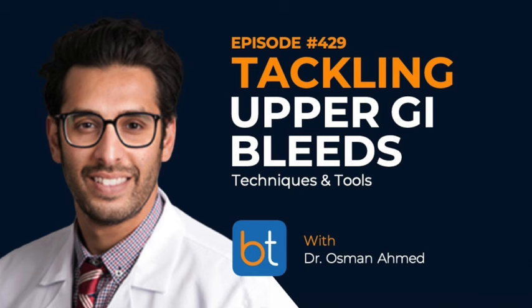Yeah, but it's challenging because sometimes it's the reverse curve that really helps you select the vessel because of the angle, but the C2 helps you get distal. So it's kind of like what's in between. I've seen people use a SIM1 or SIM2. Yeah, maybe a SIM1 or SIM2. That could work too. It's just tricky to get those further in, like you were saying.